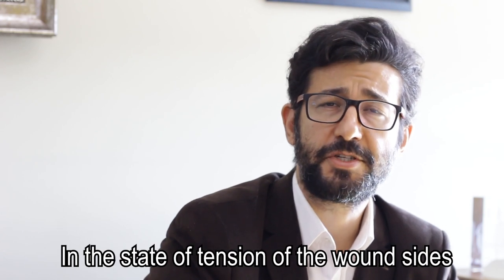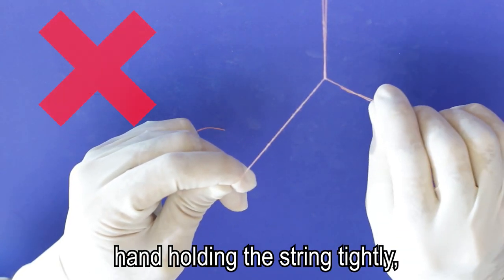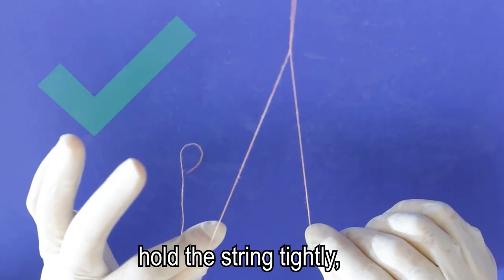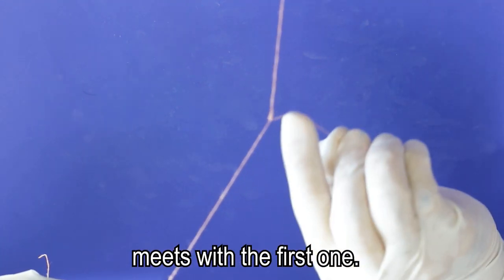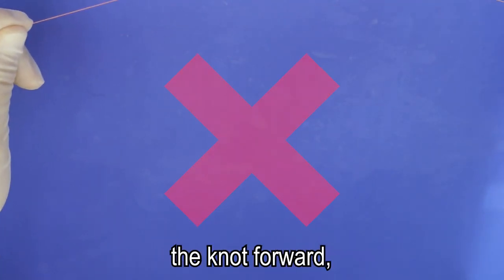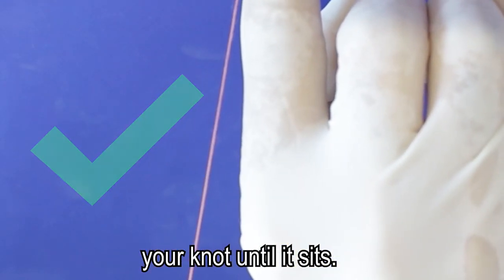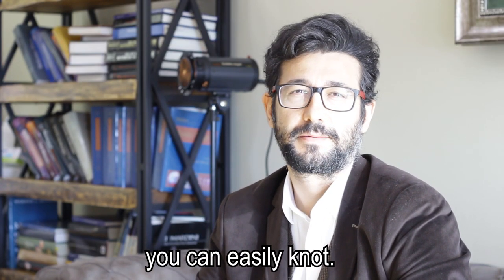In the state of tension of the wound sides, if you don't let the contralateral hand hold the string tightly, your knot will be displaced. So after the first knot, hold the string tightly during the second one, meaning with the first one. Don't open your hands to move the knot forward. Your index finger should guide your knot until it sits. By this trick, even in shallow areas, you can easily knot.